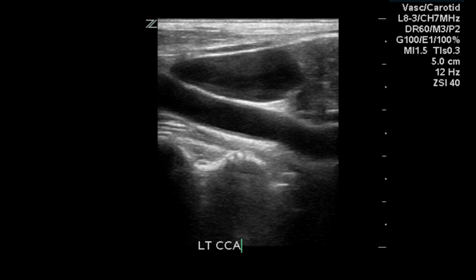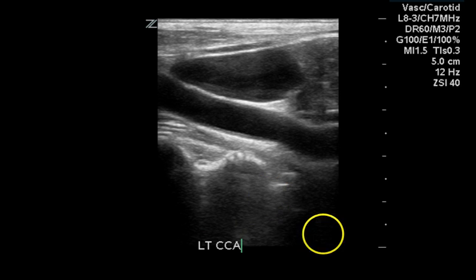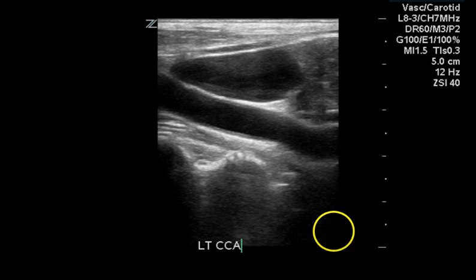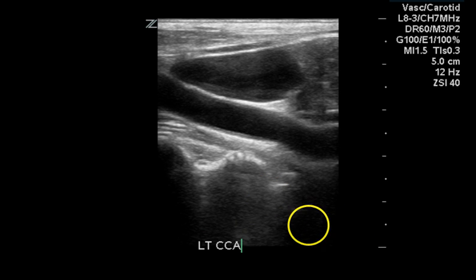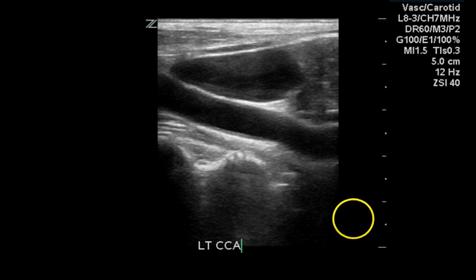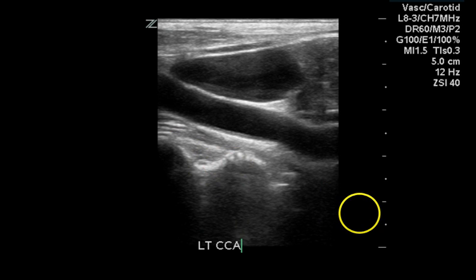This is a longitudinal image of the left common carotid artery. There is no evidence of significant disease, perhaps a small amount of minimal thickening. The depth on this image could be adjusted to provide a larger image and more diagnostic information.